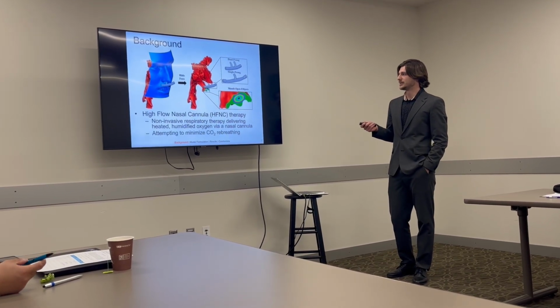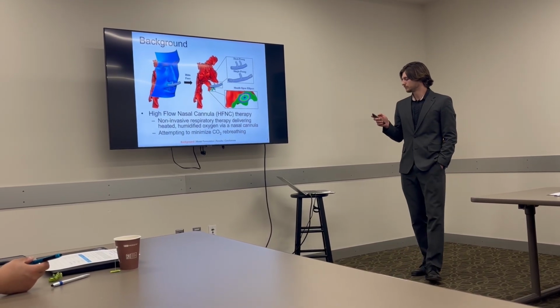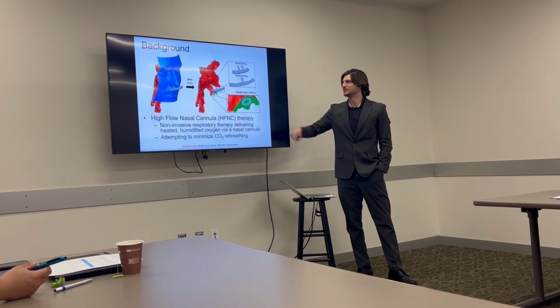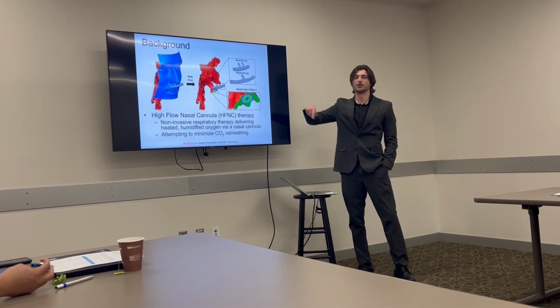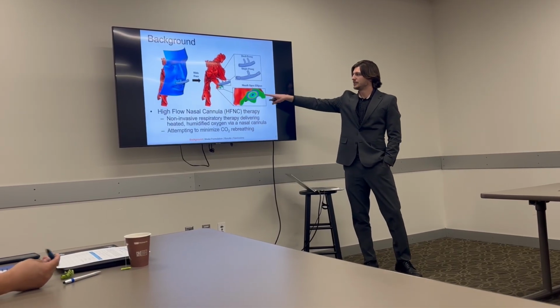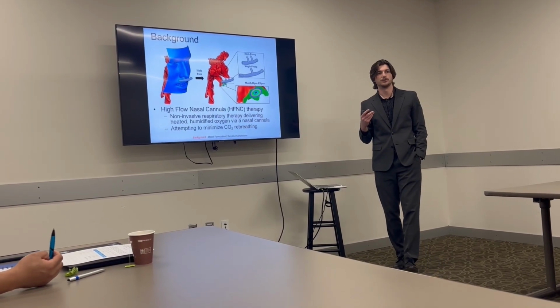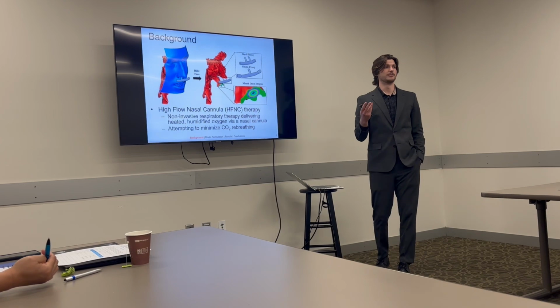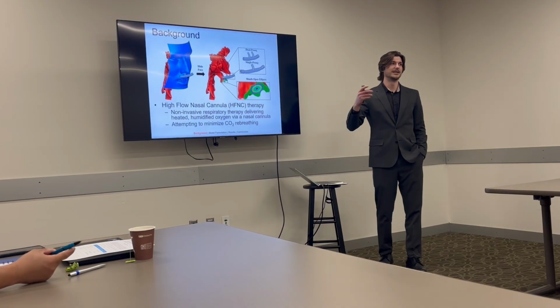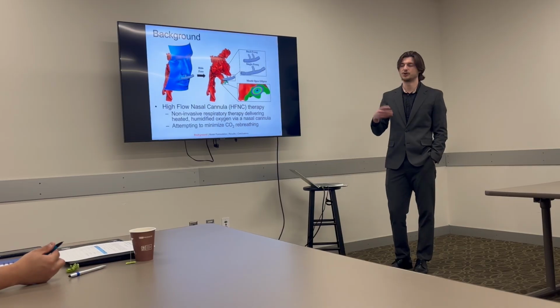We have the upper airway up here with two different nasal cannula geometries. You can't really see the laser pointer on here, but we have two different cannula geometries. One is more of a standard dual prong geometry, and the other is a single prong. We also have these mouth open ellipses, so we tested different mouth opening settings, and we wanted to be able to test this without remeshing the domain, because we know that an unstructured meshing procedure like we're using here can induce some unexpected variations if we have to remesh every time we want to change the mouth opening.